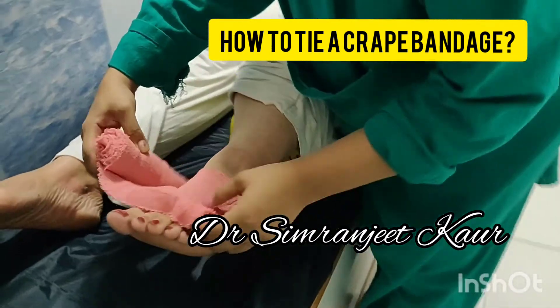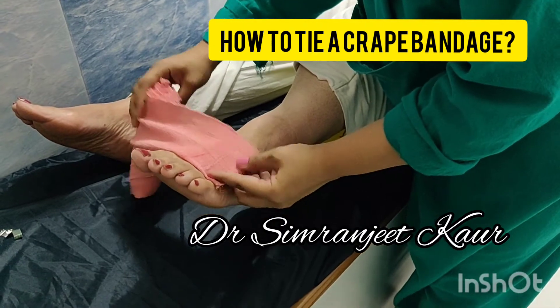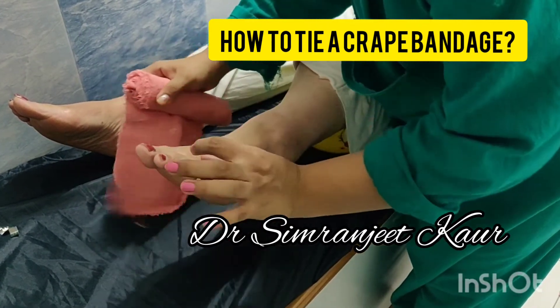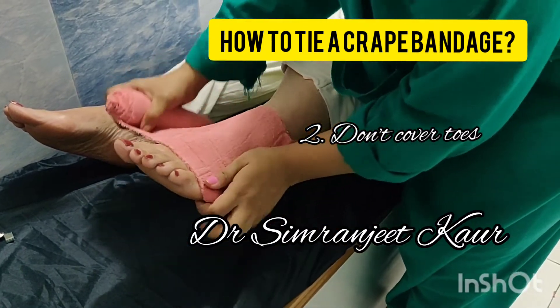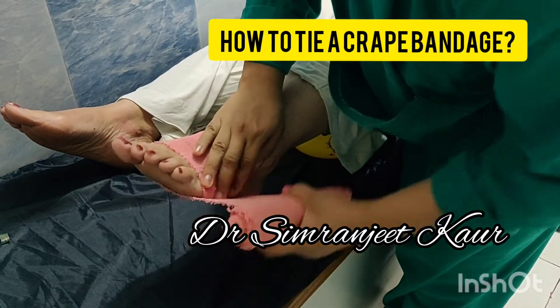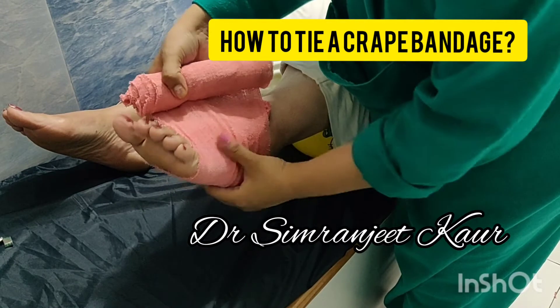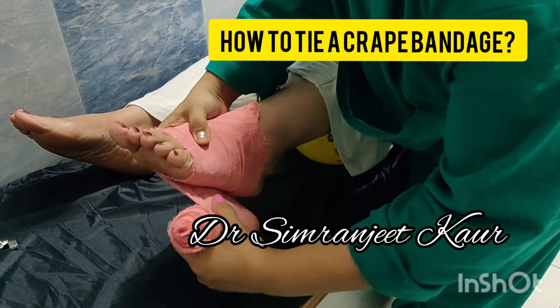This should be half the size, it should be normal. Since you have this state, I am doing it from here. It is important that you should leave your fingers. Start from here and then we are rotating it first with a comfortable layer. Like this.